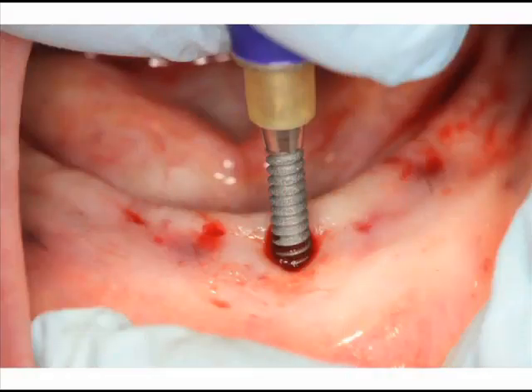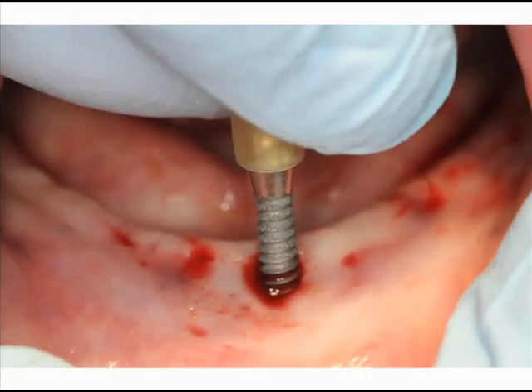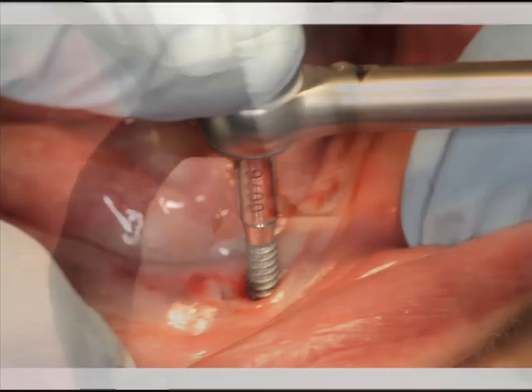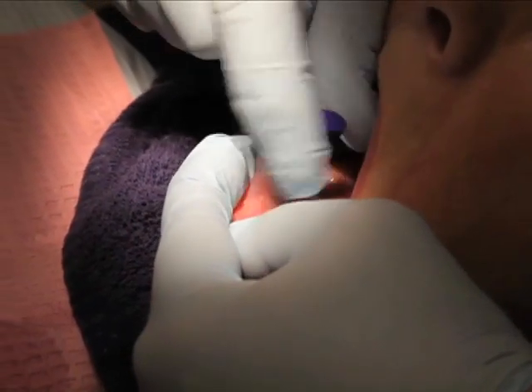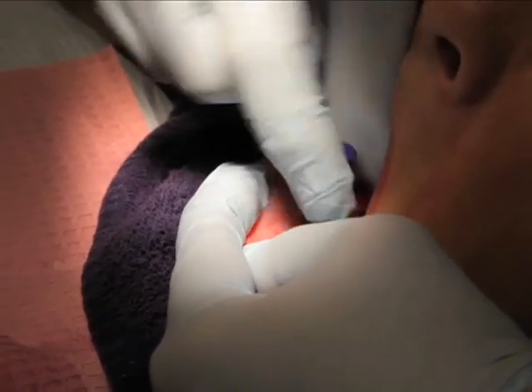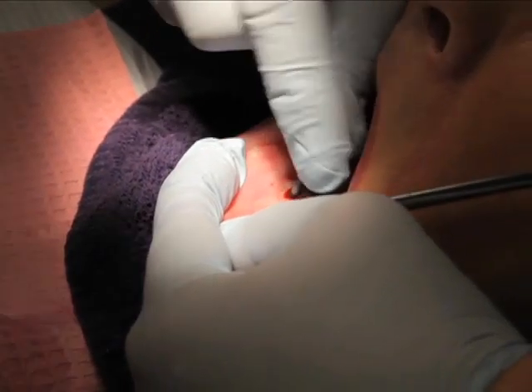The 3.0 mini Oko implant is then hand tightened to establish initial stability. Then a torque ratchet is used to thread the implant to the desired depth. Compensation of soft tissue can also be determined by using the CT scan, or it can be established by measuring the soft tissue depth with a periodontal probe following anesthesia.